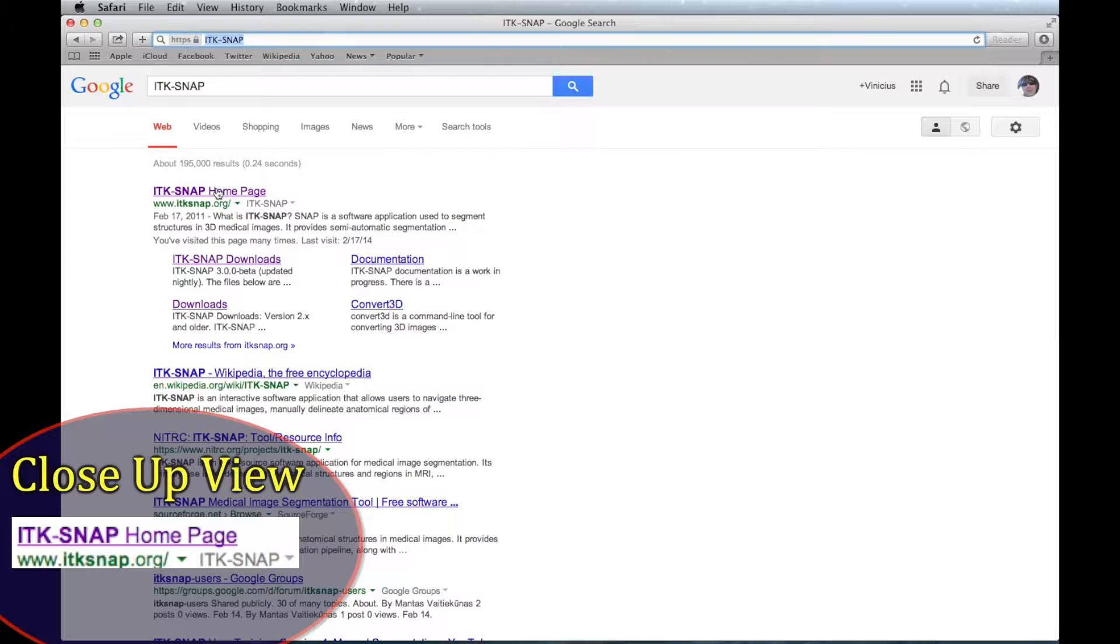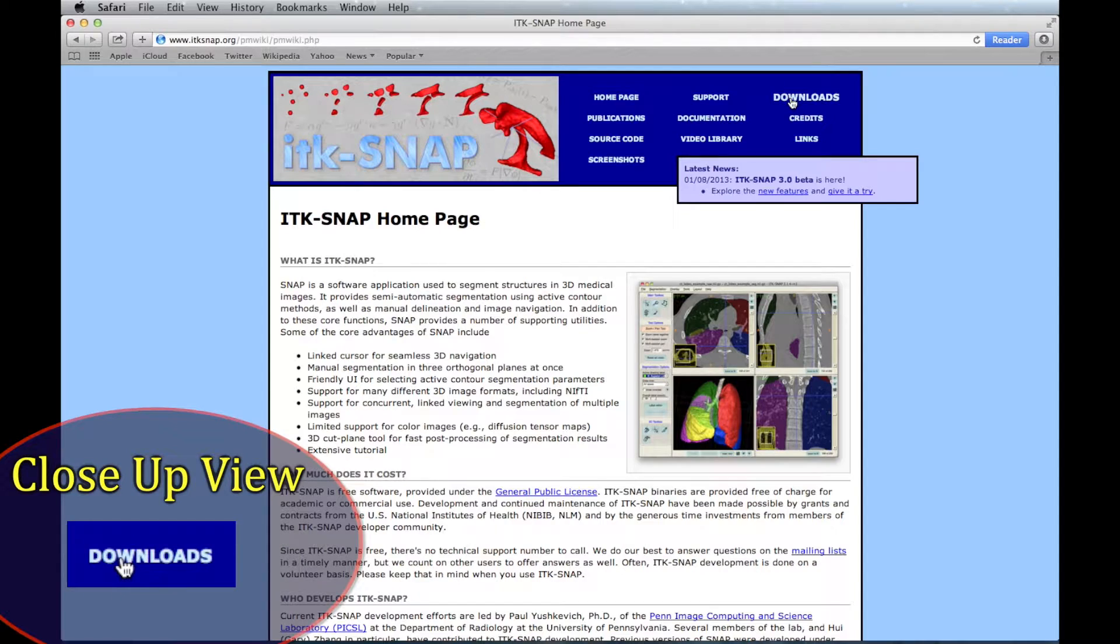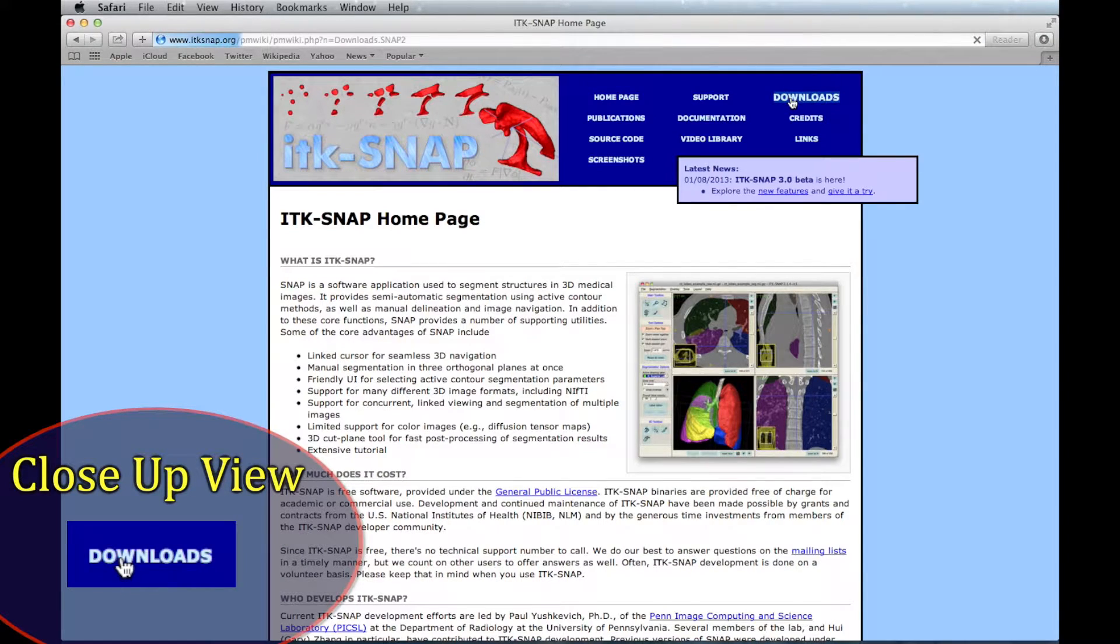Click the website for ITK-SNAP. On the home page for the ITK-SNAP website, click the Downloads link in the upper right hand corner.